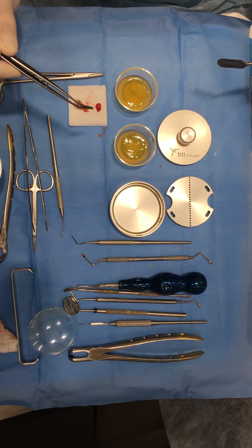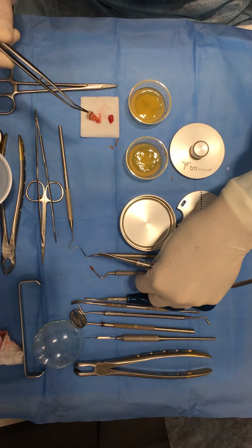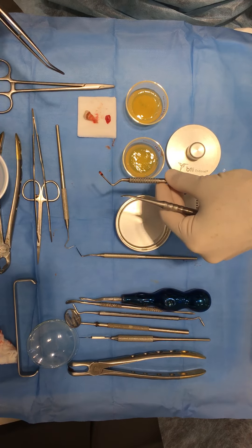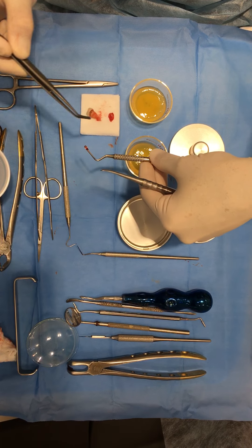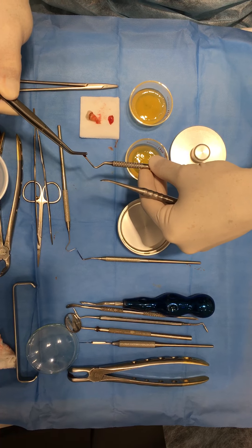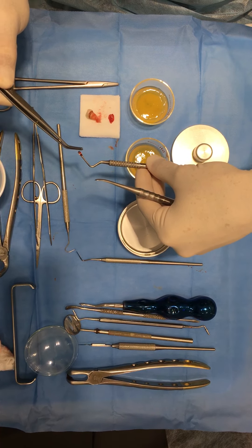The protocol of extraction and socket preservation technique is very important to use in order to remove and curate completely the abscess and the granulomatous tissue that is really attached to the hosting bone. You need to use active curettes; otherwise, if you use the rounded ones, you won't be able to remove all the attachment of this cyst.